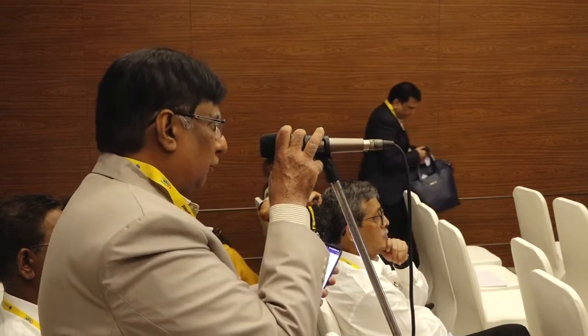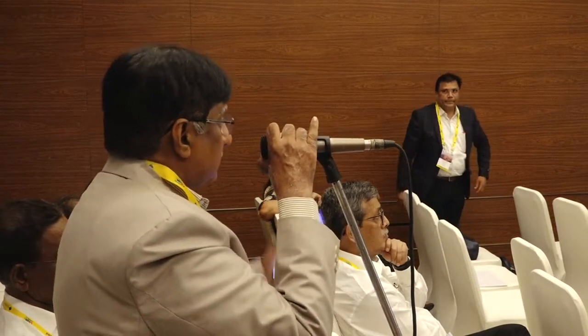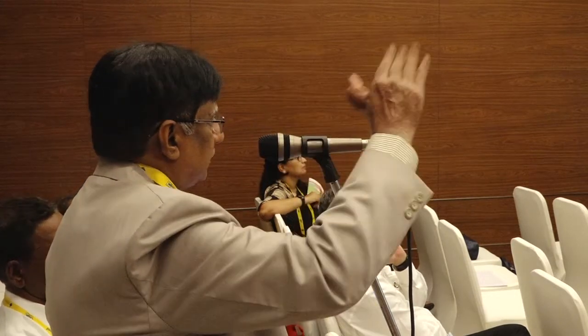What I do now, post YAG also, is I do the OCT and show that this 100% perforation has happened. Sometimes it has happened, but it is not a very adequate opening. You see it in the anterior segment OCT, and I advise a few more shots to be given. So it really works very wonderfully. And I take 4 directions in the anterior segment OCT.